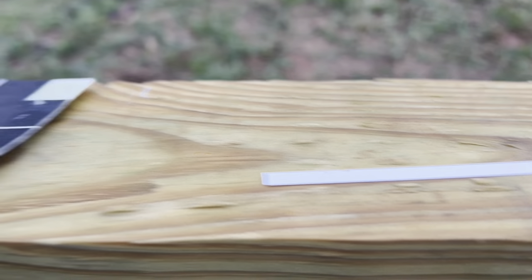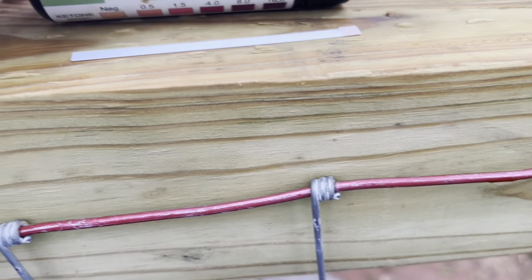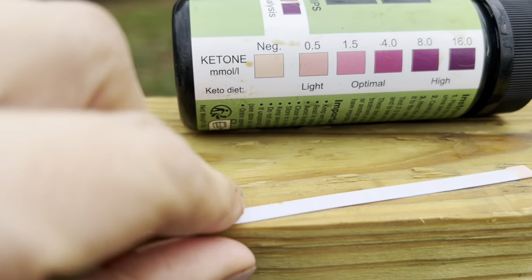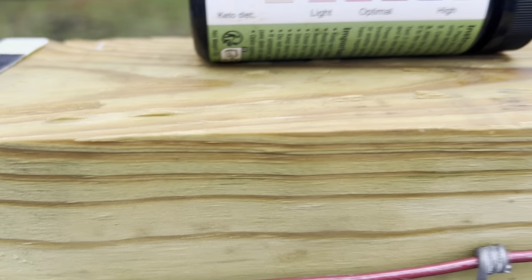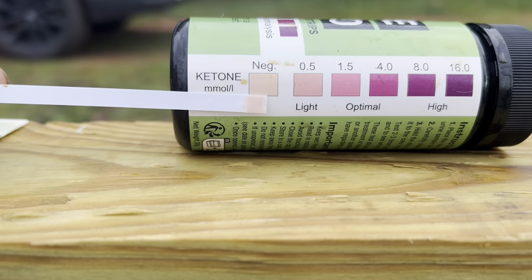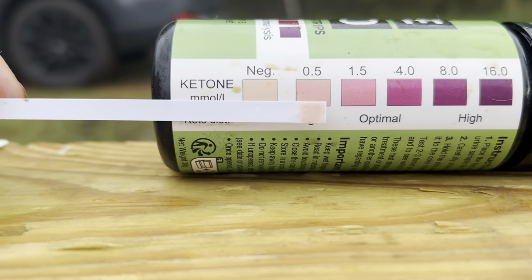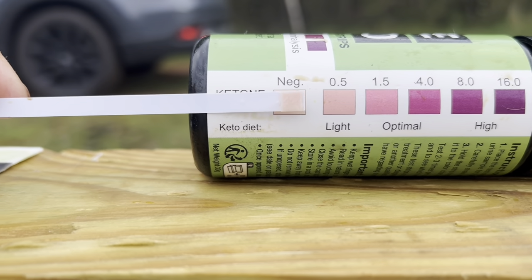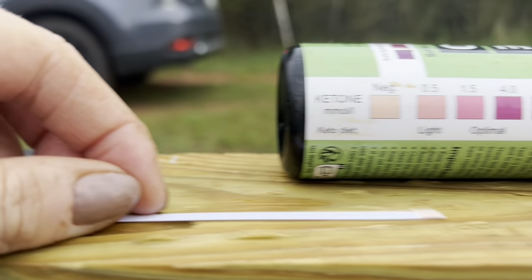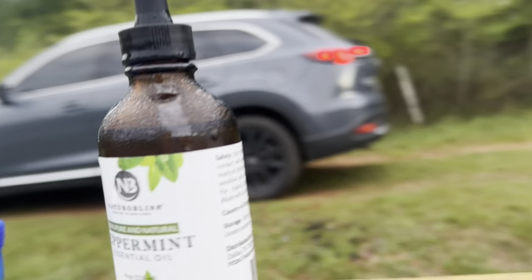Just for reference, this is a CMT mastitis test right here. Let's take a look at our results. So here's our result — we're pretty much negative. You could say this is light, but I don't actually think it is; I think we're just in the negative range. I can actually put a picture at the end of this video showing what it was like when she was very positive.